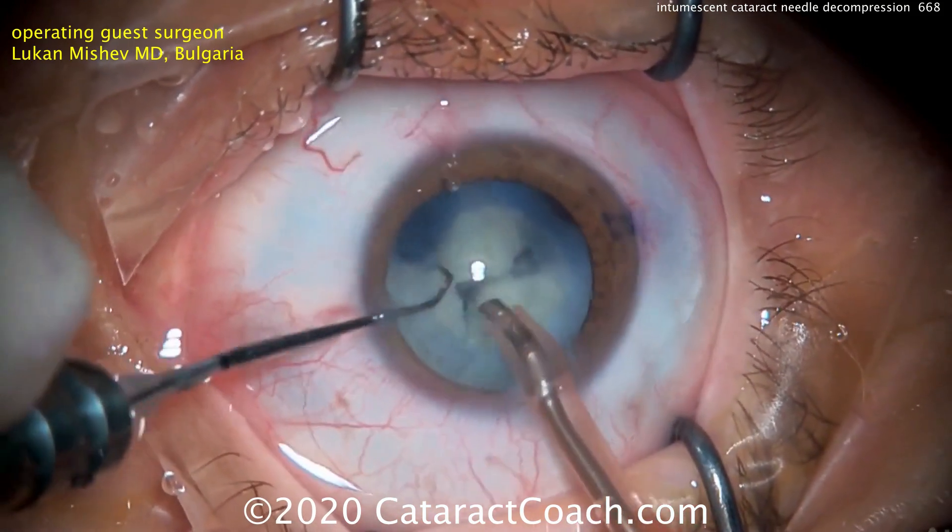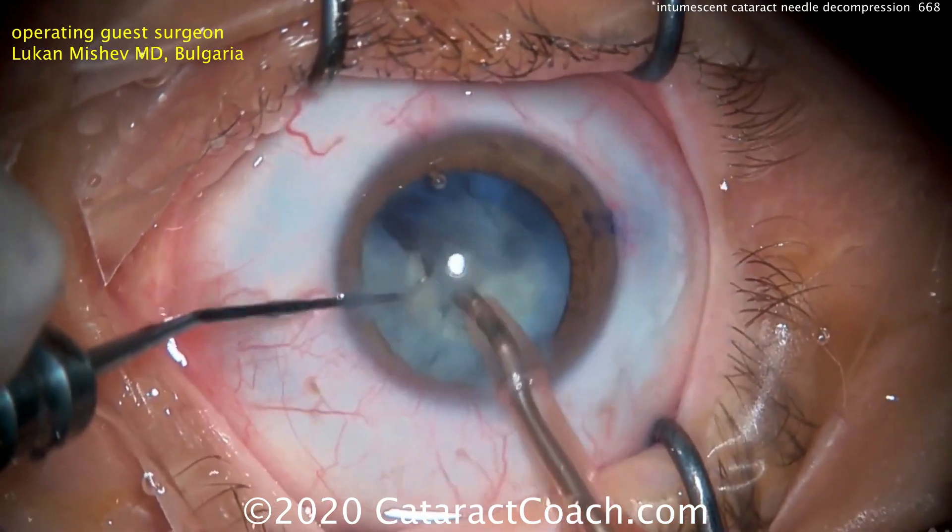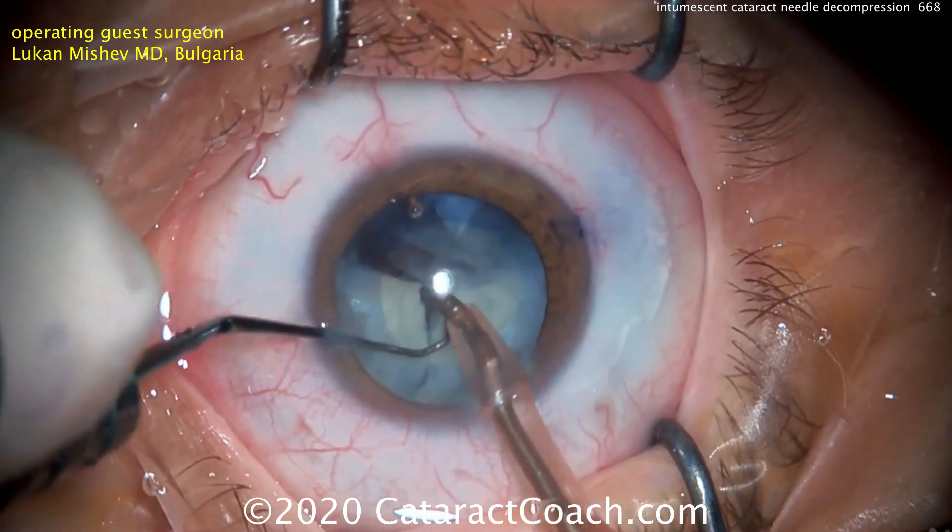All cataract surgeons are going to end up dealing with an intumescent white cataract in their training as well as many times throughout their career, so it's imperative that we learn to deal with this.